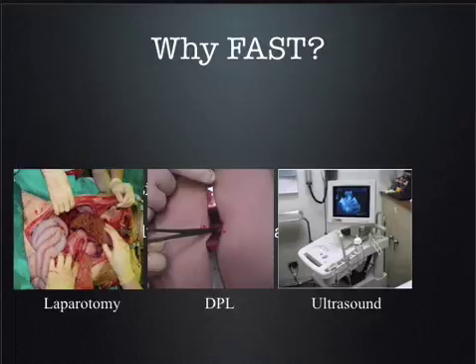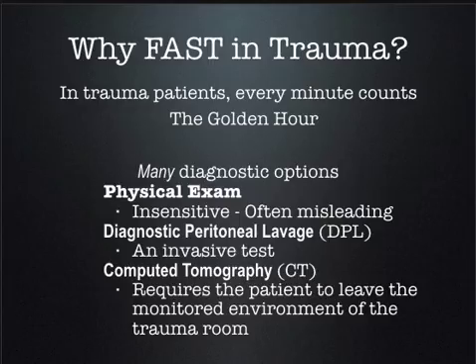So why do you want to use ultrasound when you have a lot of other modalities like surgery, CT scan, those kind of things? Well, in the trauma patient particularly, it's like the original indication for ultrasound. In the trauma patient, every second counts, really every minute counts. So the quicker you can make that diagnosis, the faster, better, smarter you are, as we talked about before, then the better you can take care of your patients. You make diagnoses quicker, you can get them to OR quicker, you can get them definitive treatment quicker. So that's really important. And you also find that your physical exam really stinks.